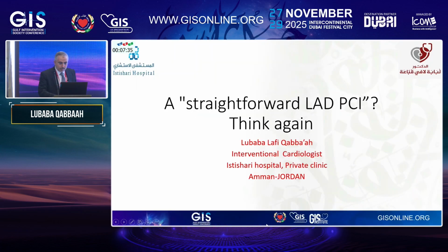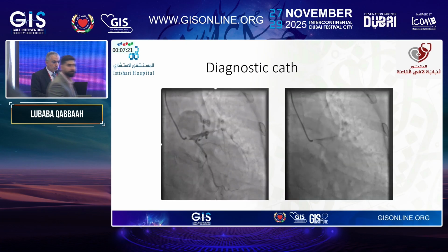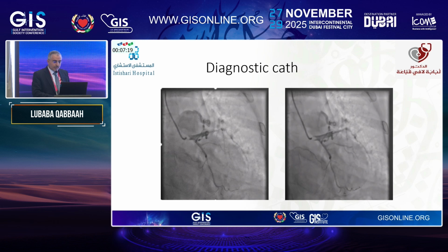Yes. Our case is a 43-year-old male patient, no risk factors except smoking, presented to the emergency room complaining of typical chest pain. ECG and labs were okay, and the echo was unremarkable. So we came to the cath lab; this is our first shot.